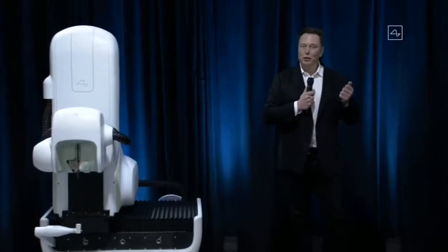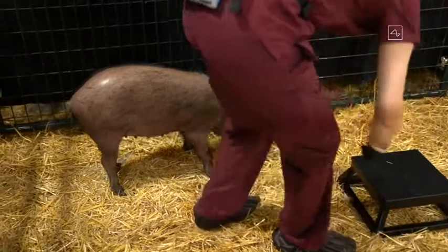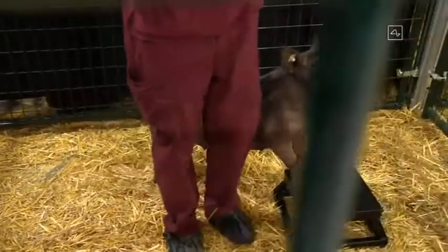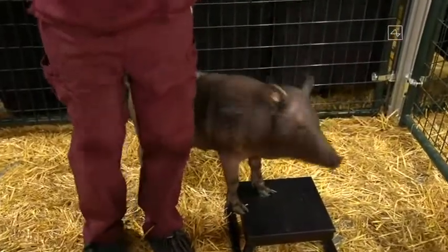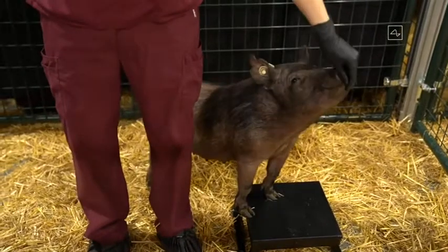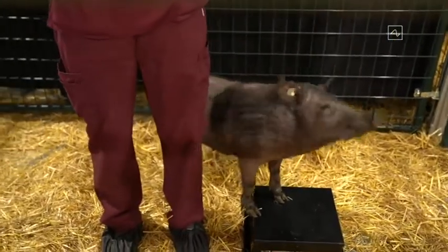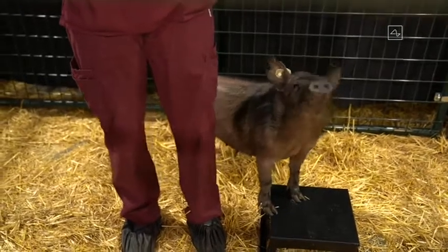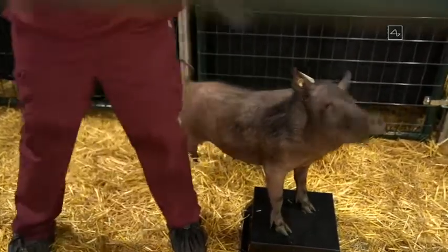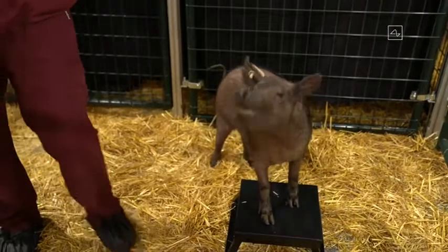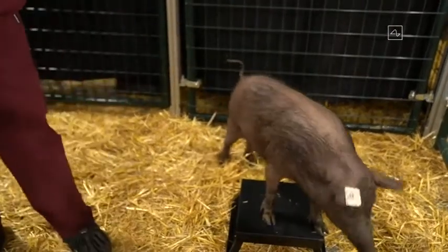Does it actually work? What I'm excited to show you, I call it the three little pigs demo. So what we have in pen number one is Joyce, and she does not have an implant. Obviously healthy and happy. We're trying to get her to go through. This is how you know it's a live demo - she's trying to eat something in the corner of her pen.